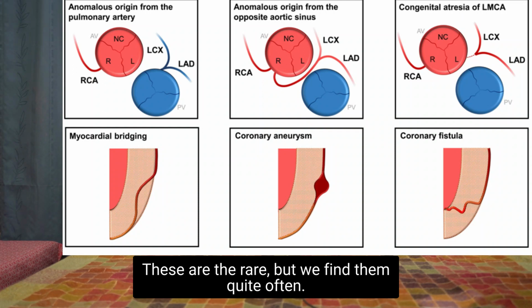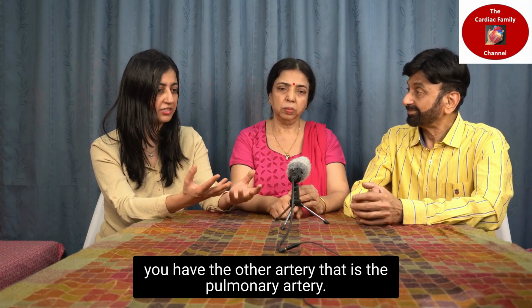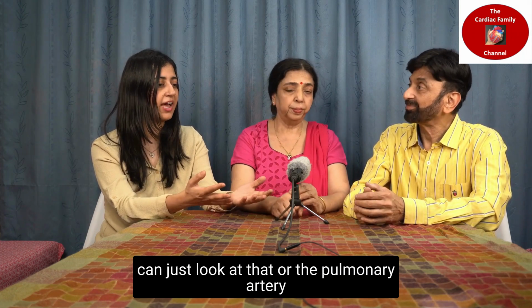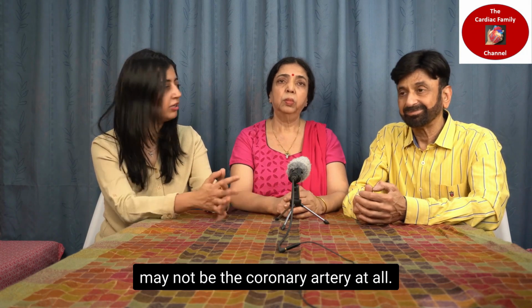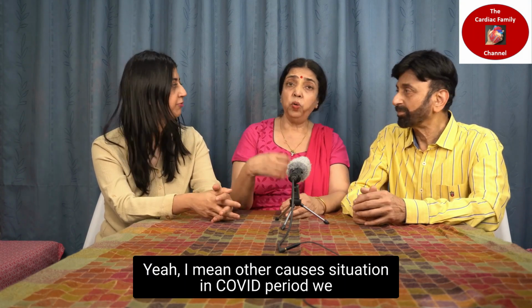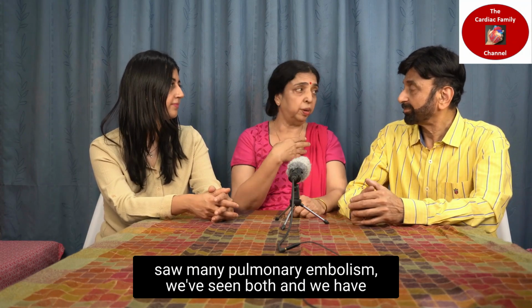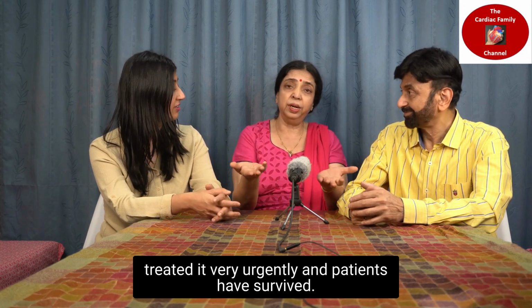These are rarer causes, but we do find them quite often. Nowadays, even when you subject a patient to any kind of CT, you can also look at the other artery, the pulmonary artery. If there are clots in the pulmonary artery, or the pulmonary artery looks very big, then the cause of chest pain may not be the coronary artery at all. It may in fact just be a pulmonary embolism. In the COVID period, we saw many cases of pulmonary embolism and thrombosis, and we treated them very urgently, and patients are surviving. So it is that important.